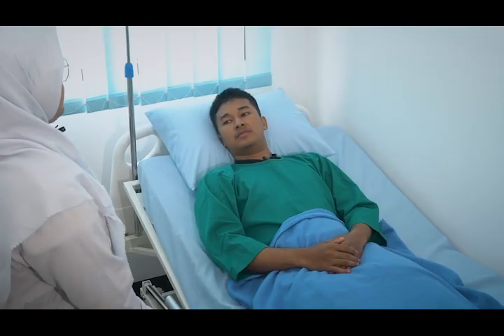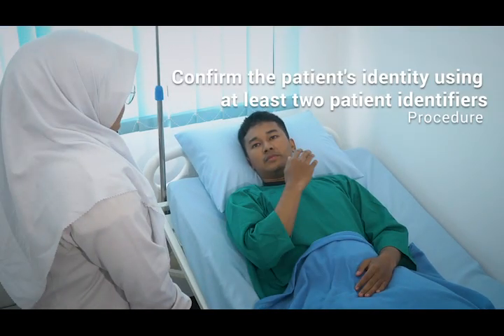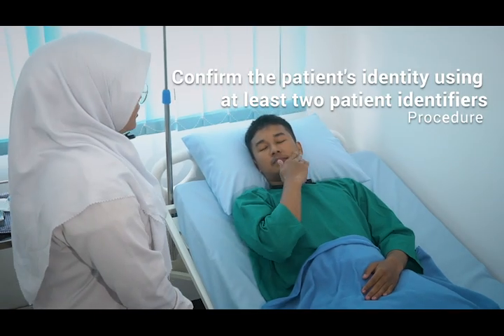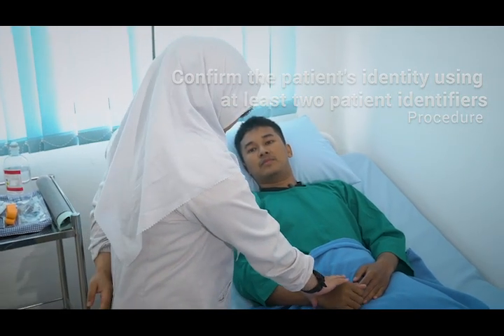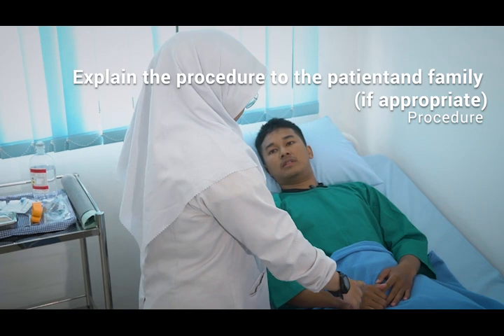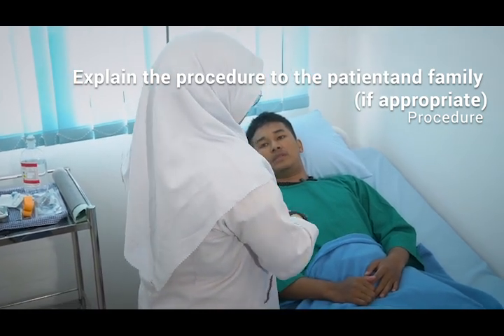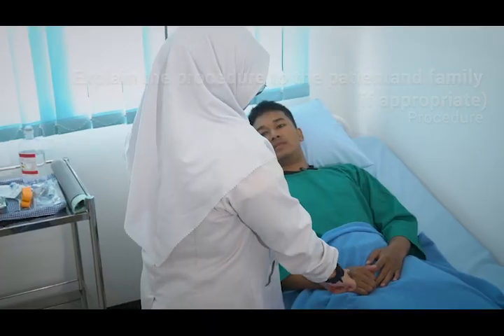Good morning, sir. My name is Alia, and I'm going to be your nurse today. Confirm the patient's identity using at least 2 patient identifiers. Can you say your name and your date of birth, please? Explain the procedure to the patient and family, if appropriate. So it's going to be an IV catheter. I'm going to insert the IV catheter for your medication, and it's going to be on your arm.